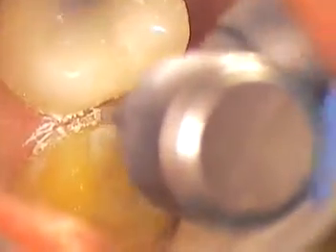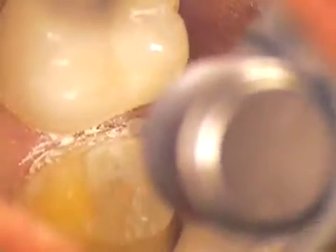Open up a little bit if you can. Okay. Tough spot. So we're also aesthetically conscious here, so we're trying to pull our margin right now a little below, once you come out of the embrasure, a little bit below the gum line, so we don't see any yellow dentin.